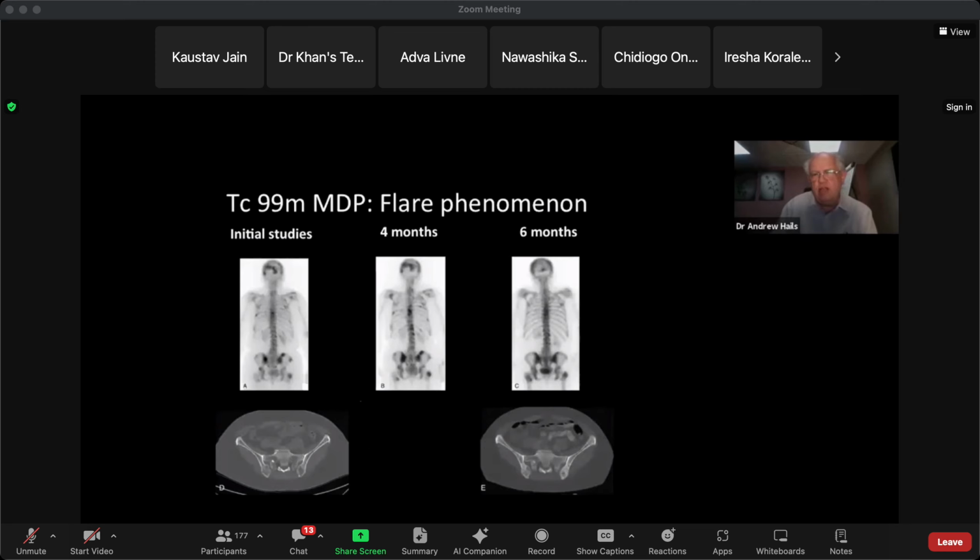what has happened, I think you were saying, was that the patient has lytic areas here, and then the patient had treatment and they became more sclerotic, and therefore they showed up on the bone scan where they weren't showing up on the first image. And then the treatment progressed, and the areas of bone went back to normal.